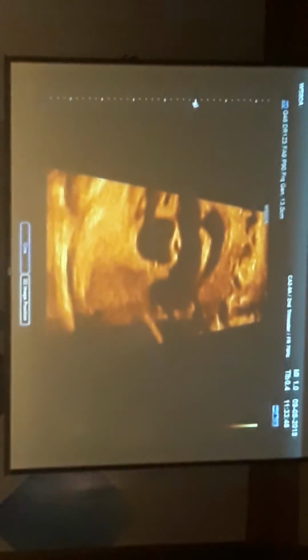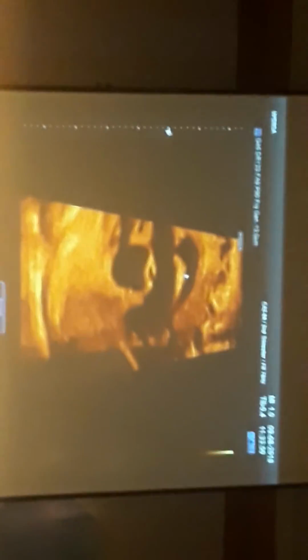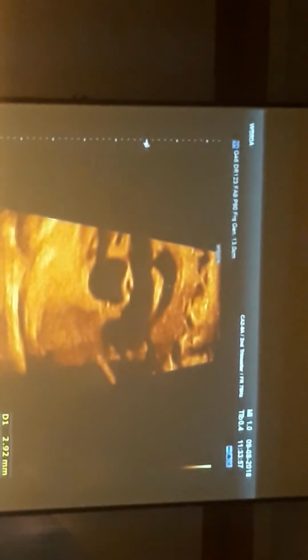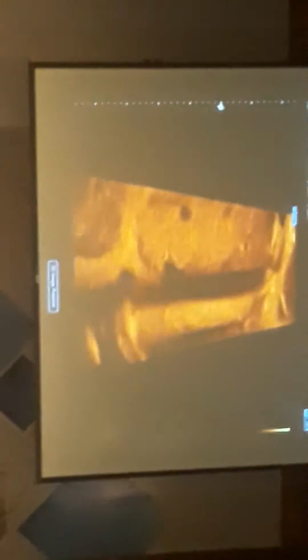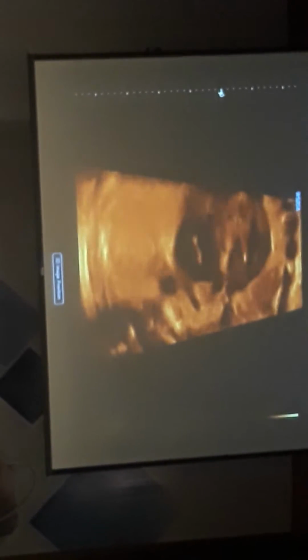You can measure the z-score, if you want, and plot it out. But you can see with good imaging that the aortic arch is quite small.